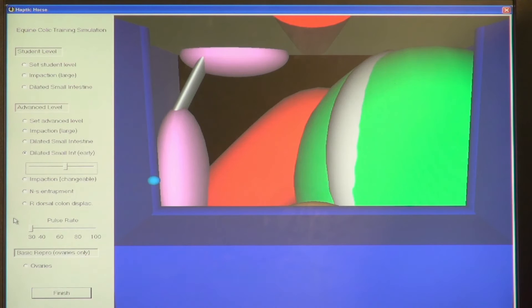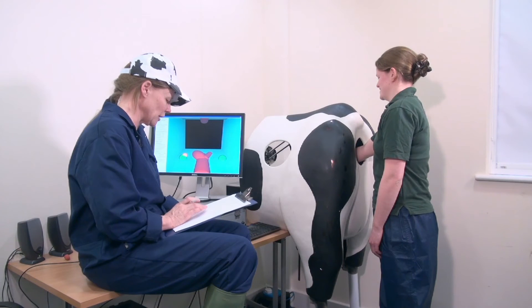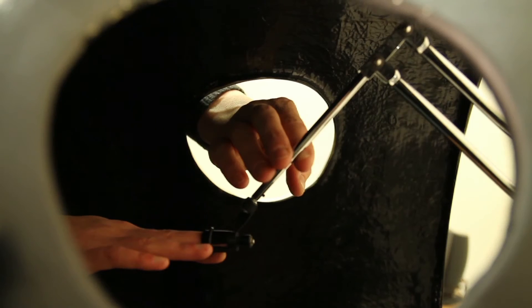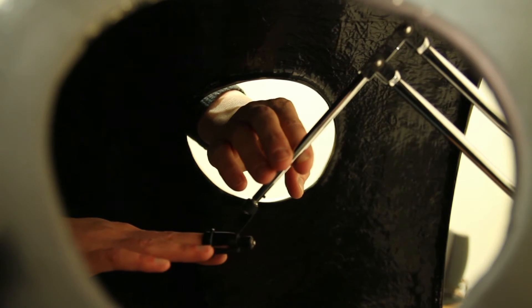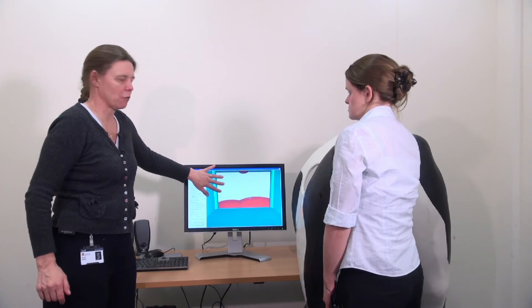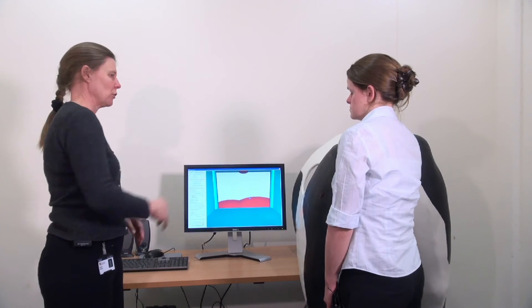In addition, because the animal's organs are visible on the computer monitor, the instructor can see exactly what the student is doing and direct their movements, something that isn't possible with a real animal.